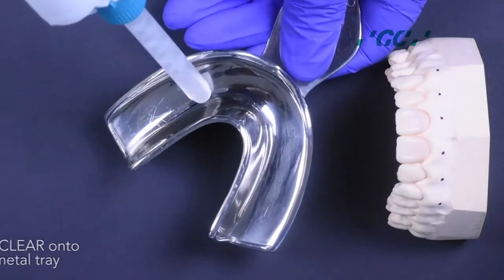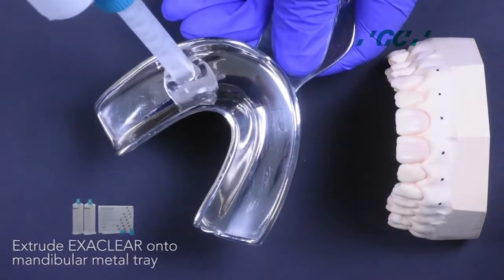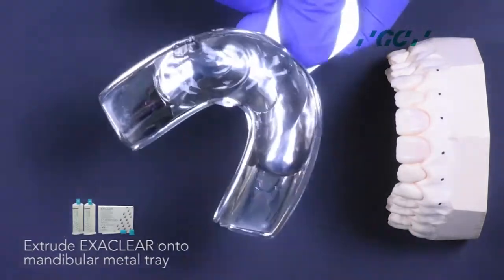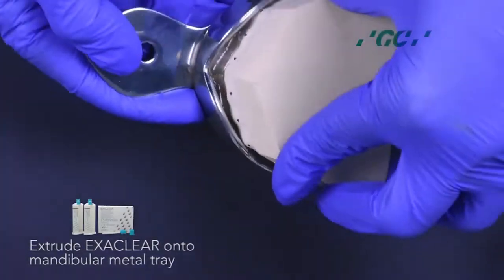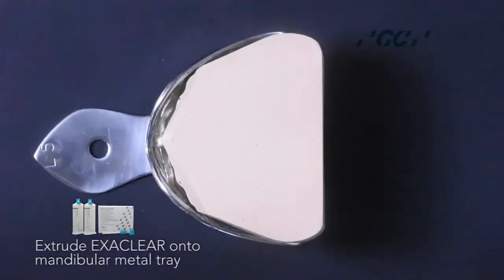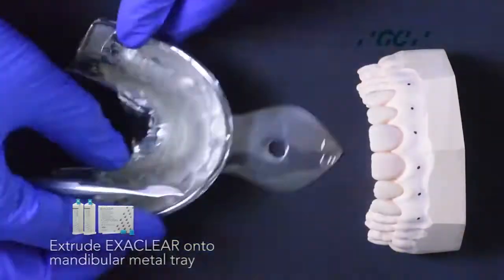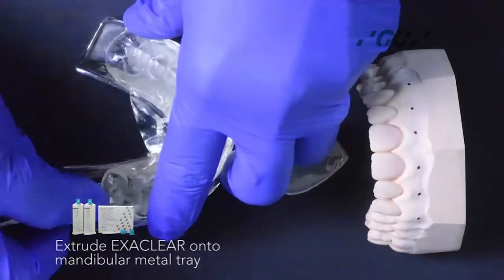Once done, extrude the Exaclear into the mandibular metal tray and take an impression of the waxed-up diagnostic model. Exaclear is a crystal clear vinyl polysiloxane material whose transparency offers total visual control and is ideally suited for the injection moulding technique.